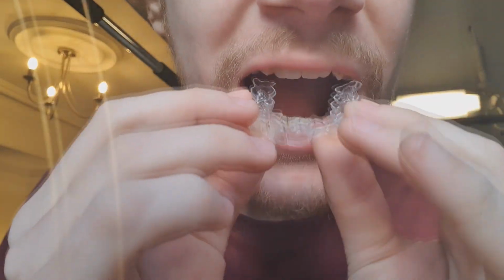Once the aligners are back in, I tap my phone again to tell it that the aligners are back in. That is pretty much the cycle that I will repeat 3 times a day, apart from the soaking in the Retainer Brite. That only happens in the morning. But apart from that, the situation is the same for lunch and my evening meal. So I'll do the exact same thing. I'll prepare the food, I'll get ready to sit down with it, and only then will I whip the aligners out, rinse them, eat my food, brush my teeth, aligners back in. And that's pretty much it, over and over and over again.